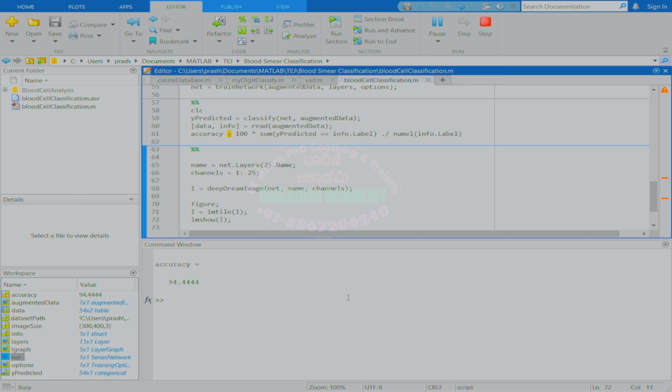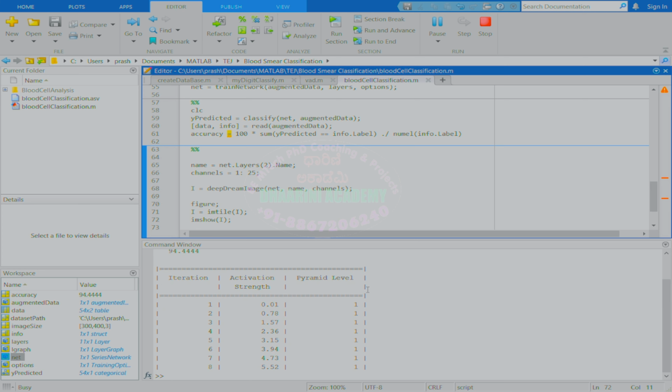Once we run this, it's going to take some time because again it has to bring all the values from the network, the weights. It has to bring them all over. So it takes some time. Again, it will run on a GPU if possible. So you can see automatically it is performing the verbose output as well. All right, let's see.